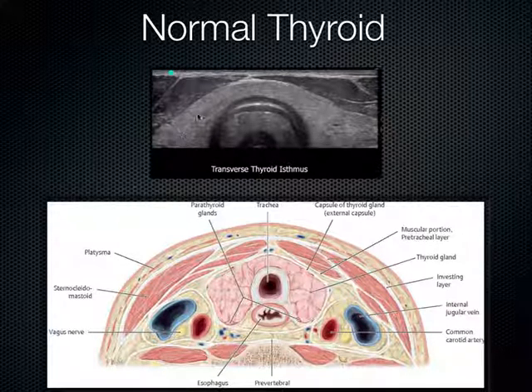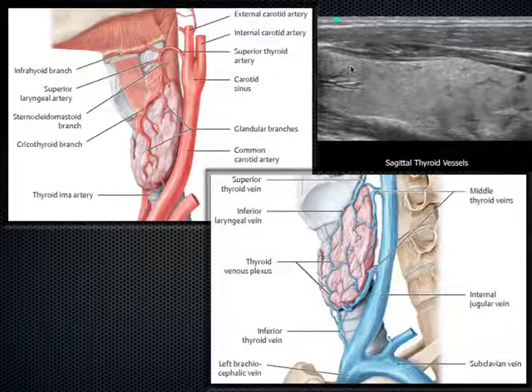The thyroid should have a very nice isoechoic texture to it, somewhat hyperechoic and isoechoic. It looks, for all intents and purposes, almost exactly like the testicle tissue. Same sort of glandular looking appearance here. This is a sagittal view of the thyroid. We can see some of the vasculature poking through it, and we can see its nice isoechoic texture.